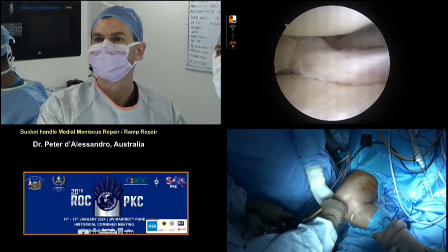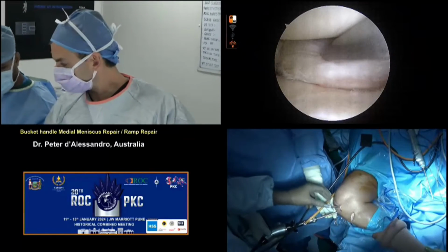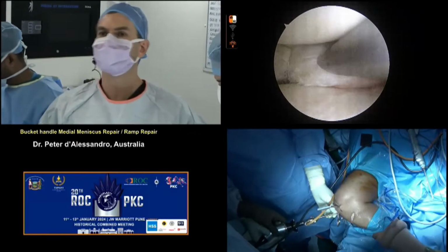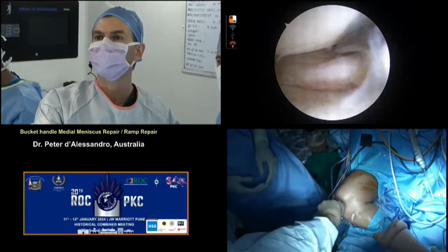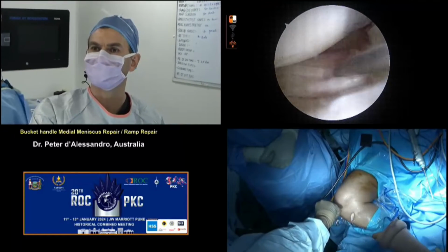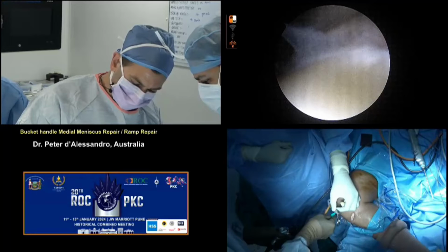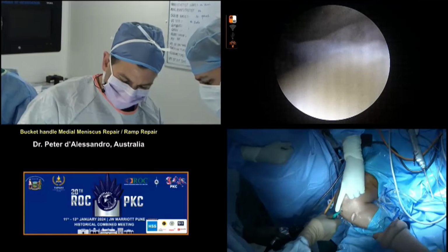Are you over-constraining that, because now you've got this radial tear, which is just adjacent to it? We've got another one of the orange ones. Yeah, so as I go to plan, I want as much fixation as I can as I come across, because the radial tear is going to be challenging, and you can see with the horizontal part coming the whole way through, this is going to be difficult for us to avoid suture pullout. So that's part of my plan, to constrain as much as I can.